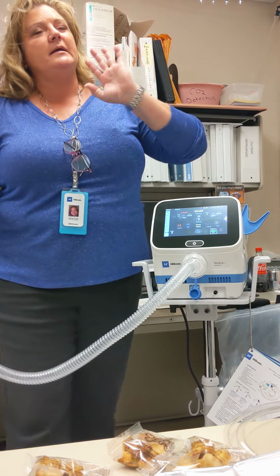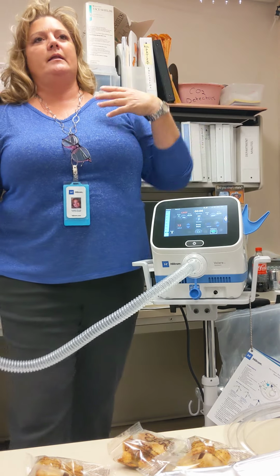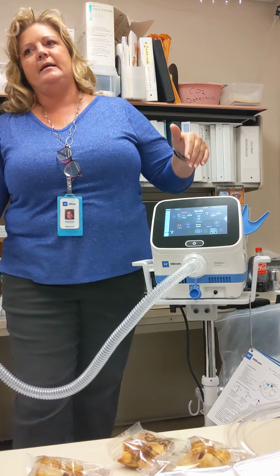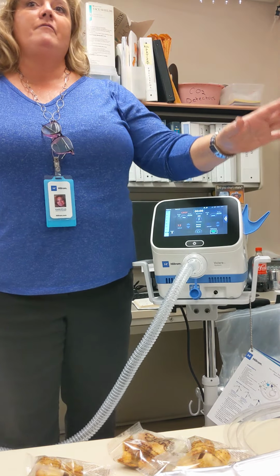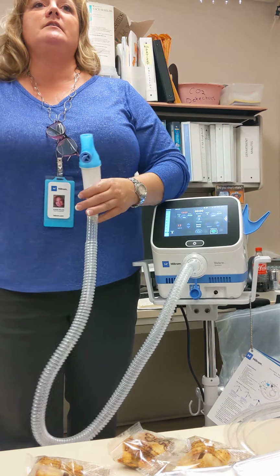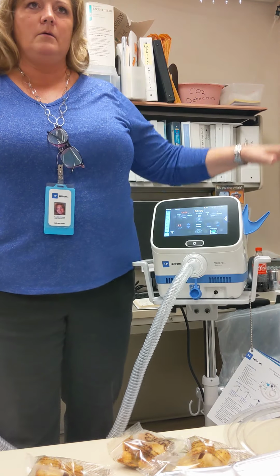The reason I bring it up, yes, he's an anomaly because he was an athlete and he had double pneumonia, so he had low respiratory recruitment, is that this can be used in your ED, can be used on every floor. I know it's a lot for you guys to ask, but it's a 10-minute treatment that makes a difference. And if you get these patients out, your time is going to be lower, right?